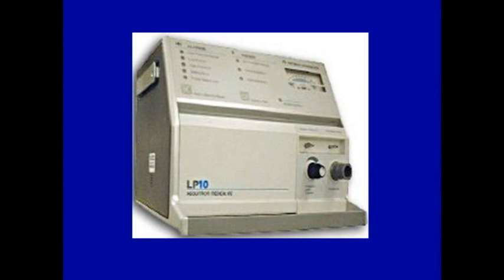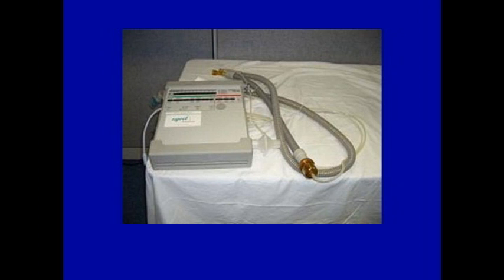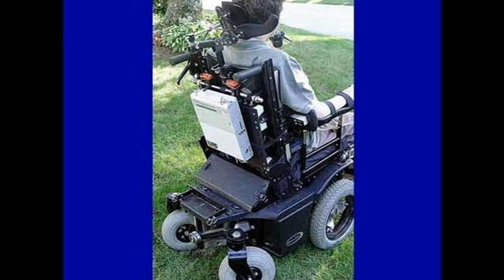That's an old ventilator. They really don't look like this so much anymore. That's a newer one, and that can hang on the back of a wheelchair. And that's a good picture of a wheelchair with a ventilator. Obviously, that's the ventilator hanging on the back.